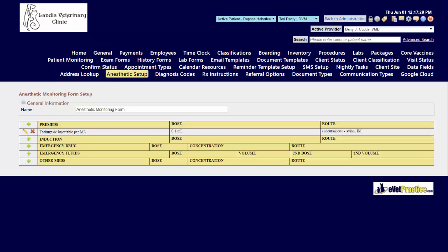Currently this form is already set up to have one of the pre-meds automatically populated whenever we go to fill out an anesthetic monitoring form.